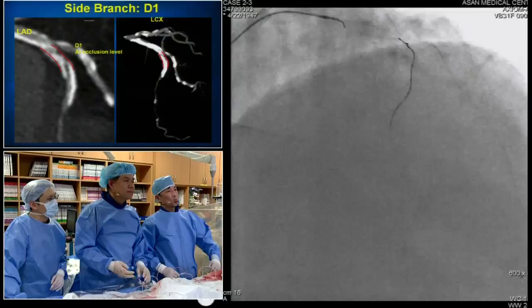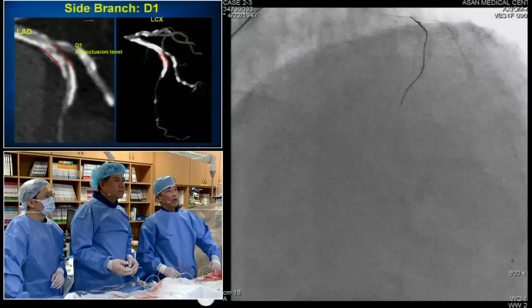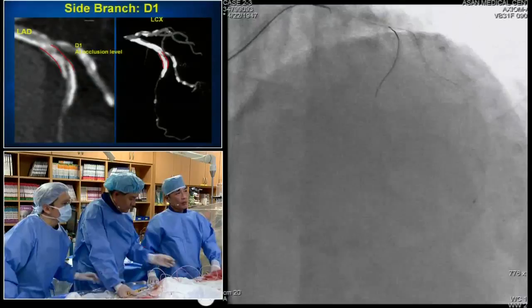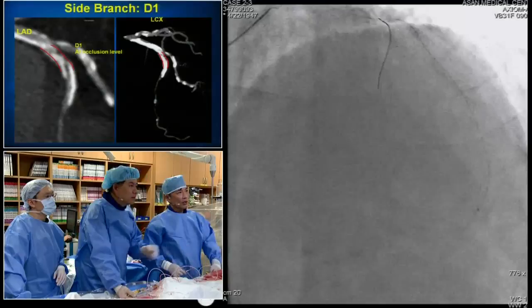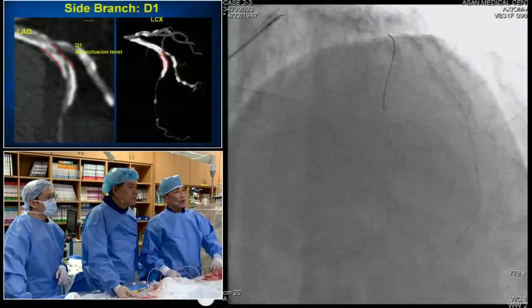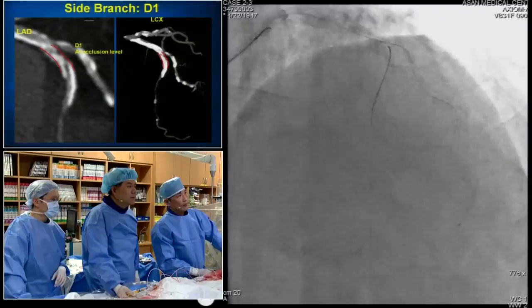Muramatsu, I strongly recommend following with a microcatheter. Yes, I tried now. Okay, I push the microcatheter. I will draw back the wire a little bit because it is distorting. Don't touch. I try to introduce the microcatheter. Wow, cannot go. Damn it. Not easy. It's very difficult.